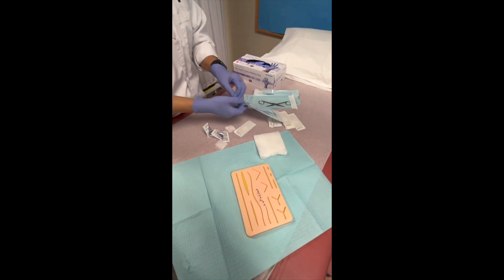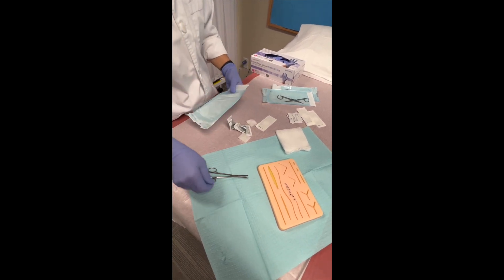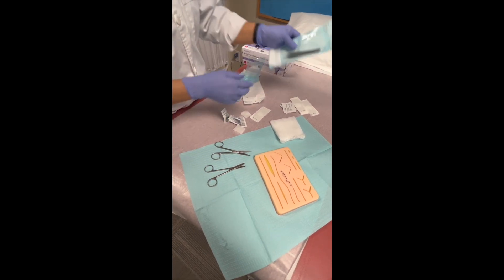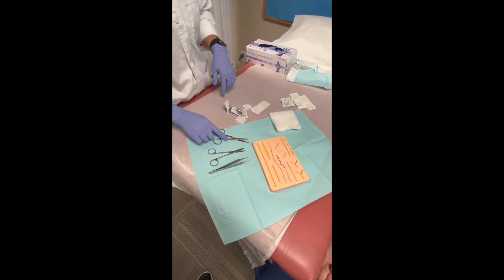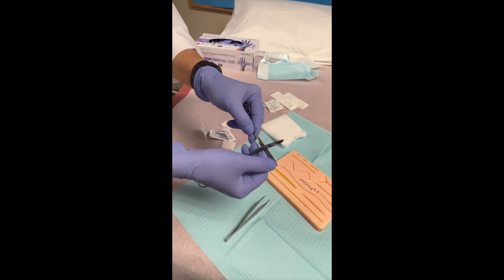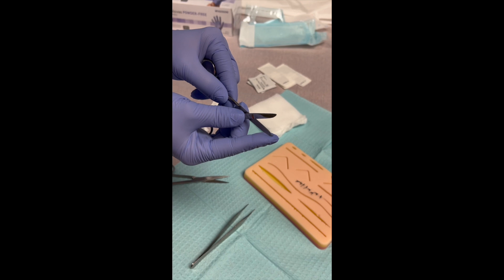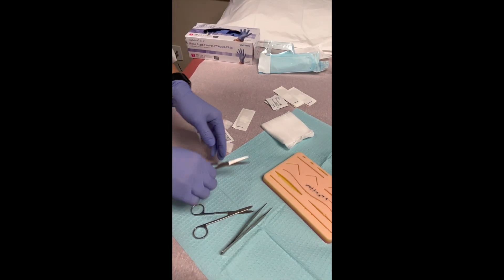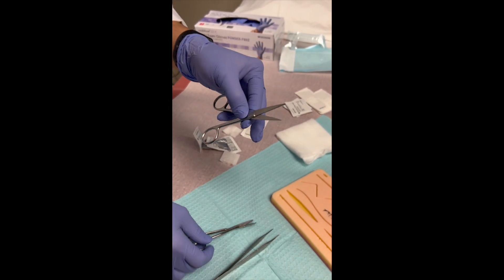I have my supplies ready. A lot of times suture kits come in one package, but I have different ones here, so I'll open them up and have them ready. I'm not using sterile technique because this is not an open wound, but I want to keep my patient as safe as I can. I have two different kinds of scissors. This one is specifically for suture removal — it has a little tongue underneath that goes under the suture, making it easy to cut without hurting the patient. I always bring a backup in case I can't cut with the first one, and of course the forceps.